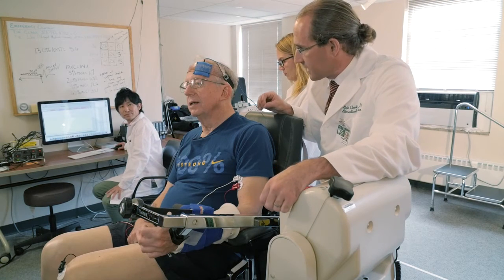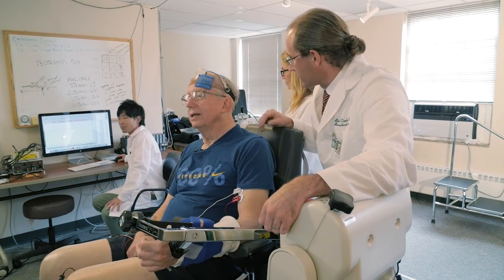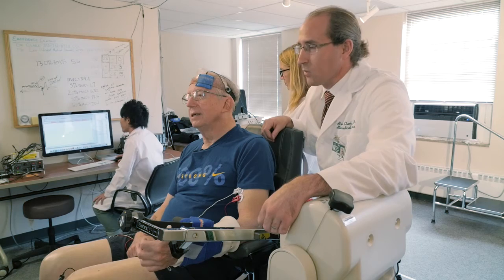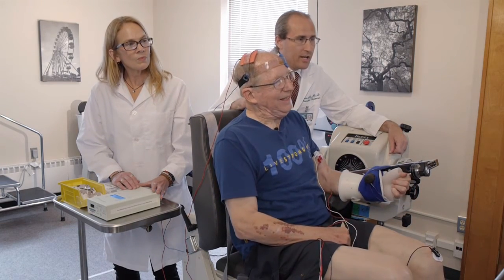We're coming up on that 17 and a half minute mark. In just a second I'm going to ask you to pull up as hard as you can. Are you ready? Yes. Okay, here we go. One, two, three — pull up as hard as you can. Pull, pull, pull, pull. And relax.